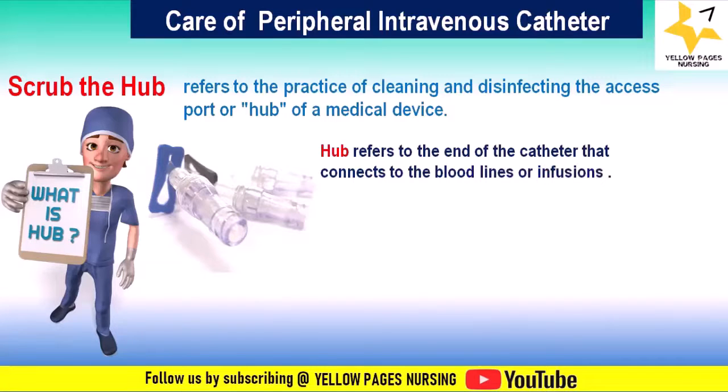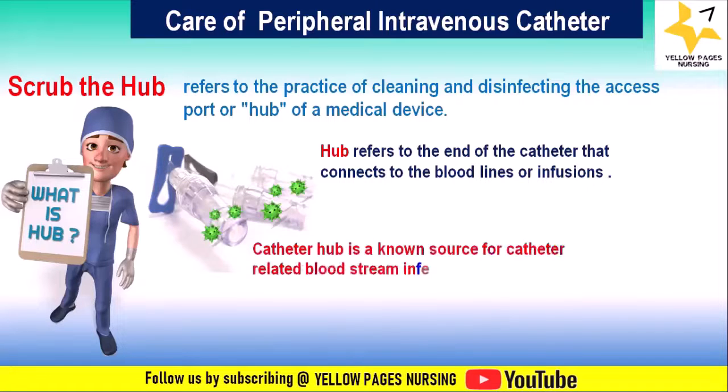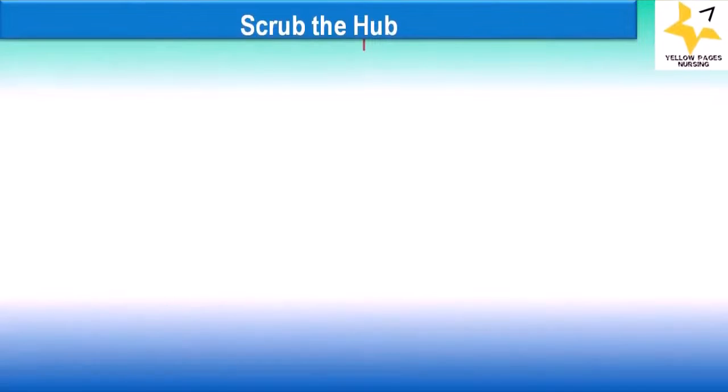Why is scrubbing the hub important? The catheter hub is a known source for catheter-related bloodstream infections, and needleless connectors are sources of microbial contamination. So, scrubbing the hub is important.